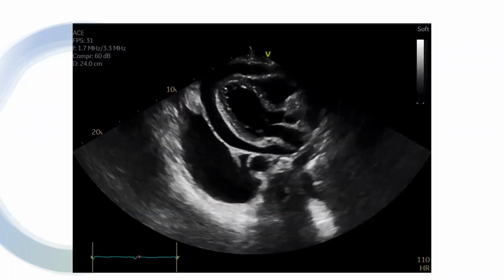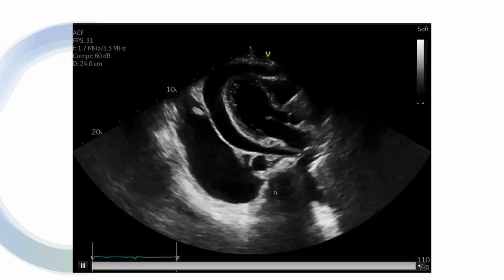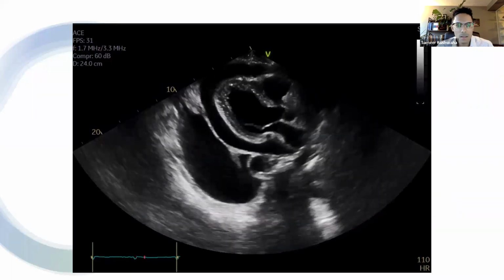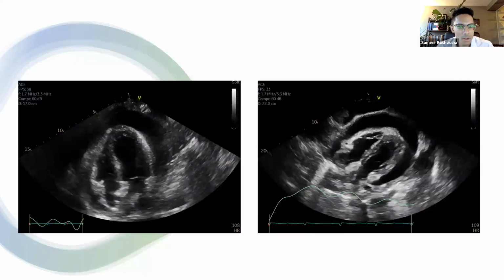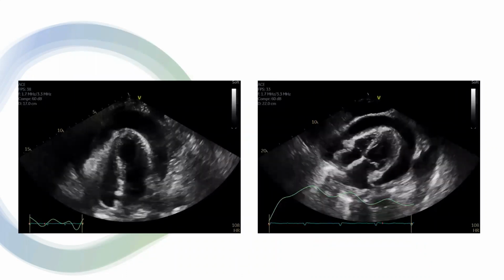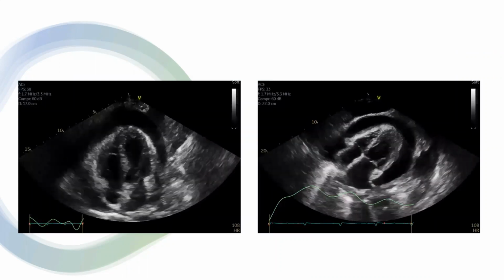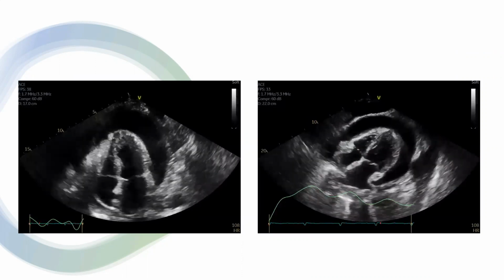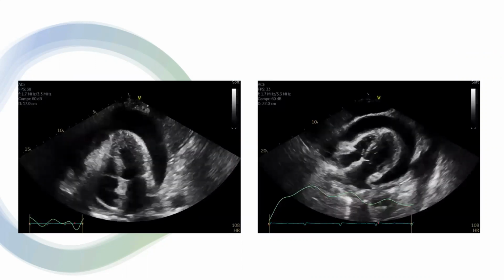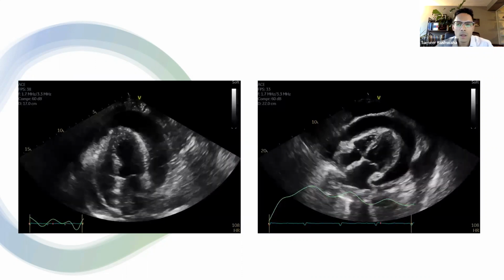So parasternal long view, you can see quite a large pericardial effusion in addition to a pleural effusion. Yeah, great. LV function looks grossly normal. And here, anything else? You can see RV and RA collapse. So it looks like signs concerning for tamponade, in addition to the heart swinging within the pericardium, in the pericardial fluid. Yeah, beautiful. So exactly.